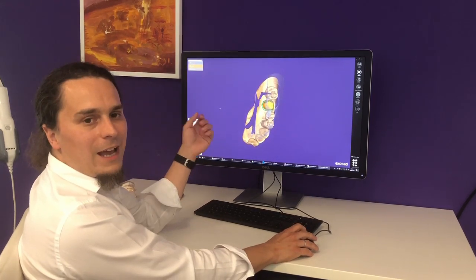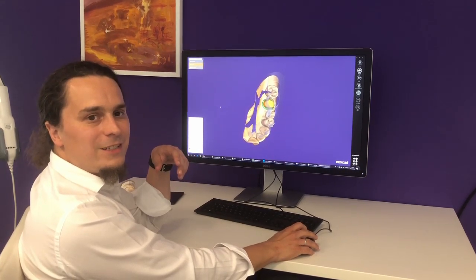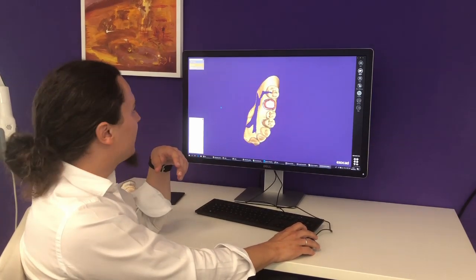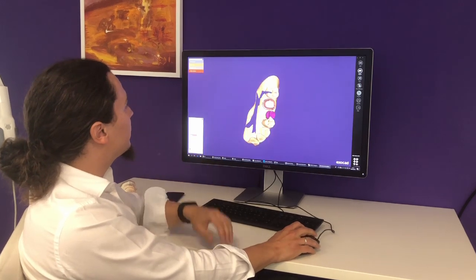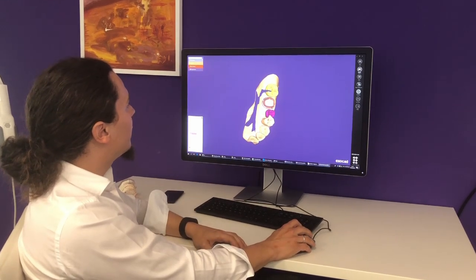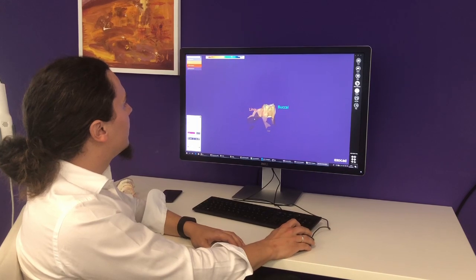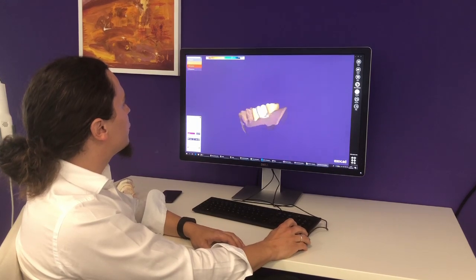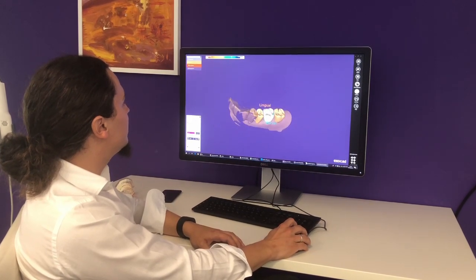Now the software will analyze the scan data, detect the adjacent teeth, and come up with an automatic placement suggestion for a tooth. I could adjust this manually but it looks fine to me.